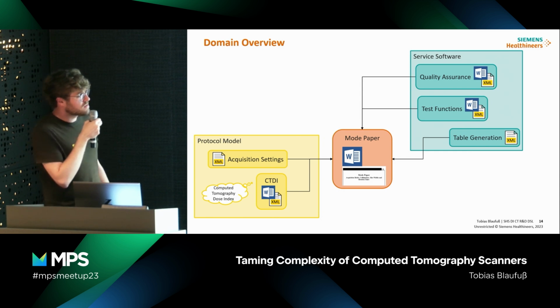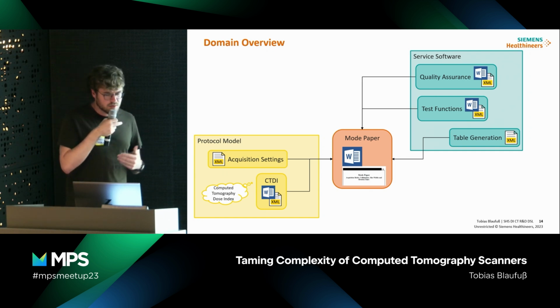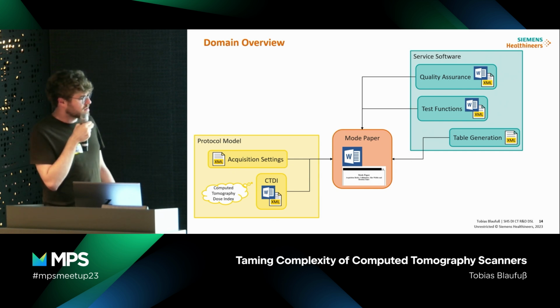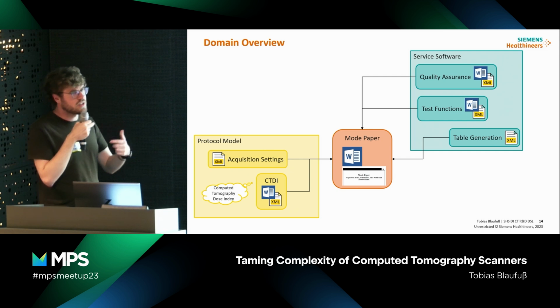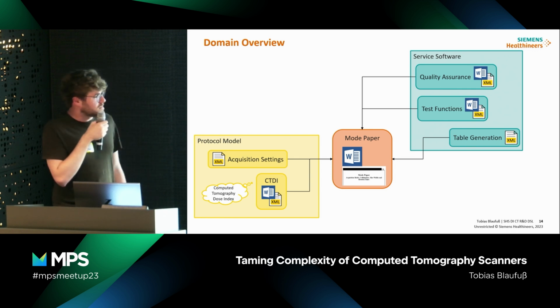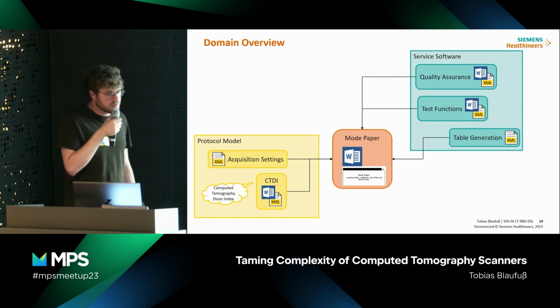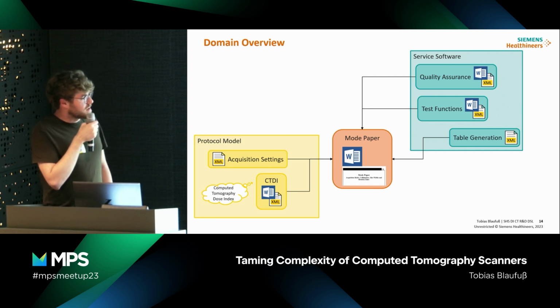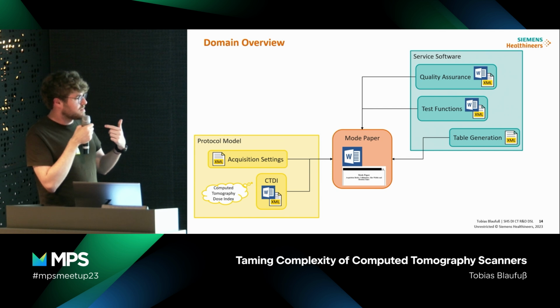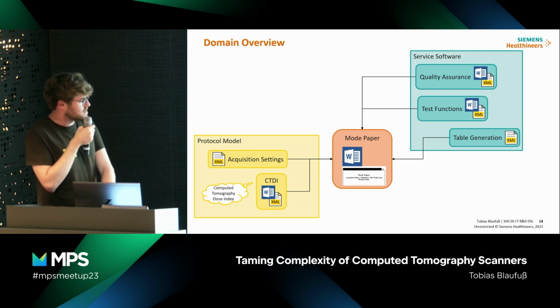And this continues. There's also the service software. So, for example, if a hardware device has to be replaced in a hospital, then the service technician goes to the hospital, replaces this device, and then certain calibrations have to be done for that, so that the scanner corrects some errors that might be in some differences to the previous hardware that was built in the system. And also we have to make sure that our daily checkups of a scanner always include what is technically possible with the system. So this also made sense.